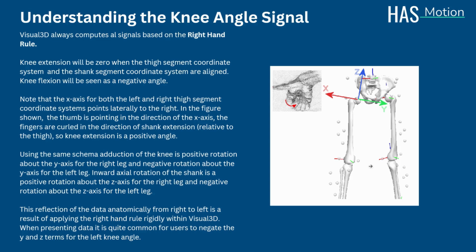Using the same schema, adduction of the knee is a positive rotation about the Y axis for the right leg and negative rotation about the Y axis for the left leg. Inward axial rotation of the shank is a positive rotation about the Z axis for the right leg and a negative rotation about the Z axis for the left leg. This reflection of the data anatomically from right to left is a result of applying the right hand rule rigidly within Visual 3D. When presenting data, it is quite common for users to negate the Y and Z terms for the left knee angle.